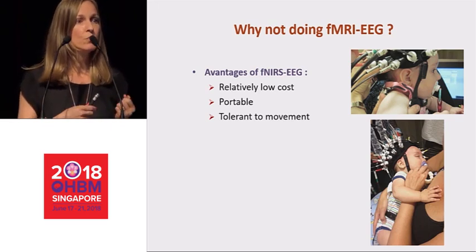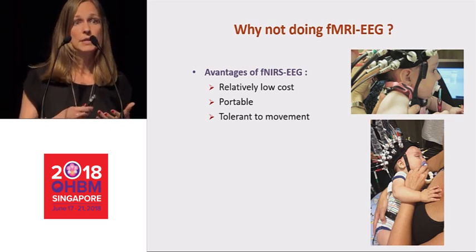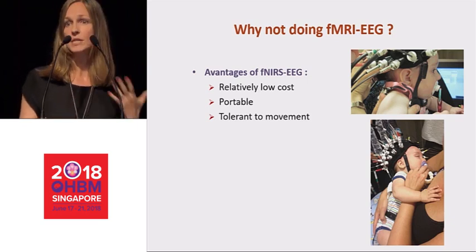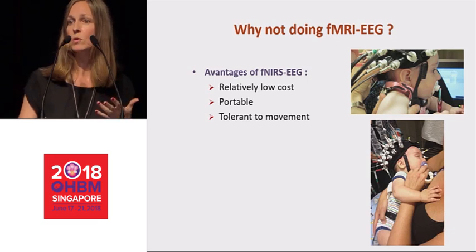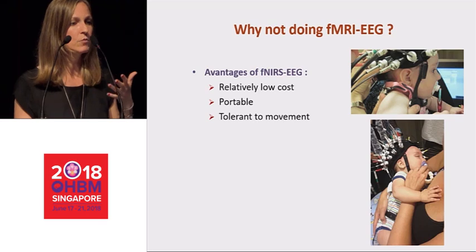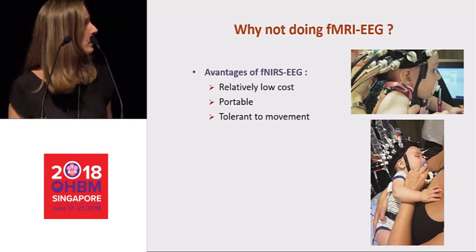So we can get a pretty good signal even if the participant is moving, or, for example, for babies having a pacifier, or if the participant is doing a language task out loud. Even with the articulatory movement, we can get a pretty good signal.